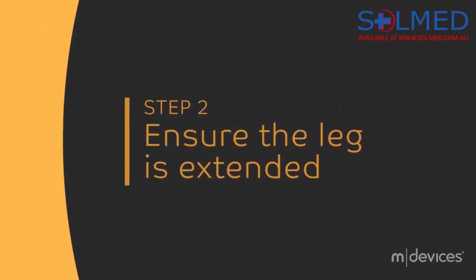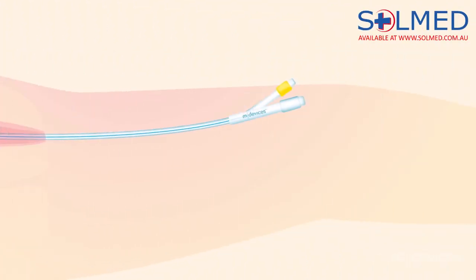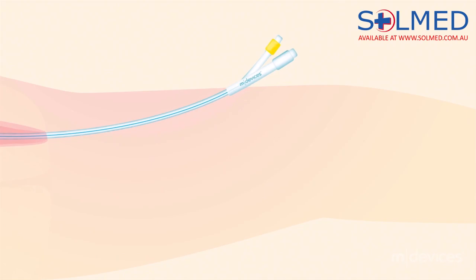Step 2: Ensure leg is extended and that the catheter has, at a minimum, 1 inch of tubing slack between the urinary meatus and the securement site before applying.